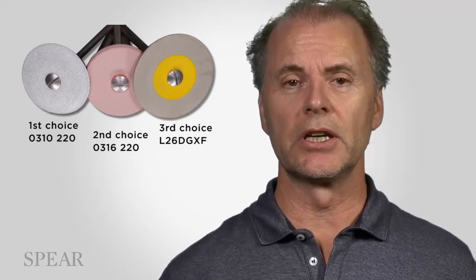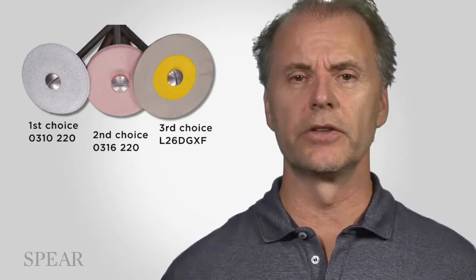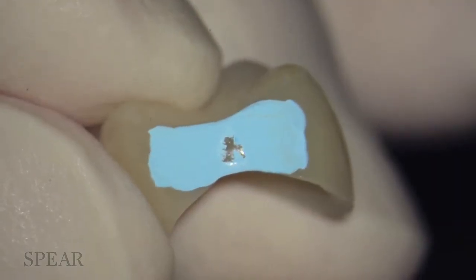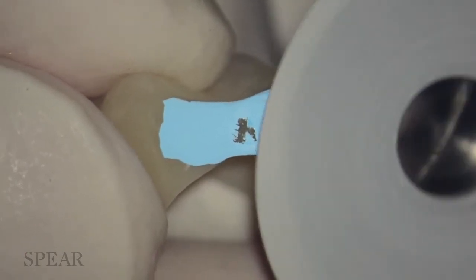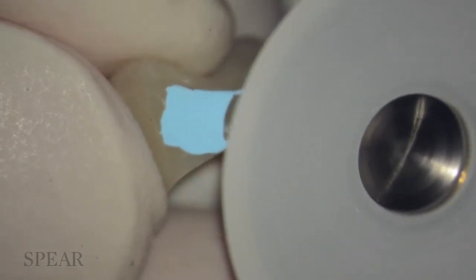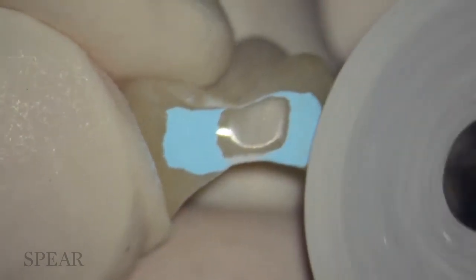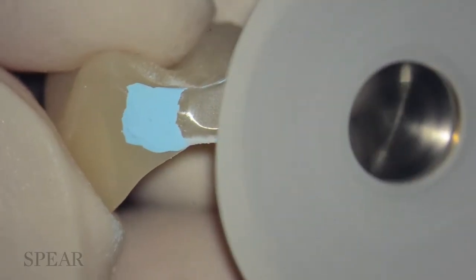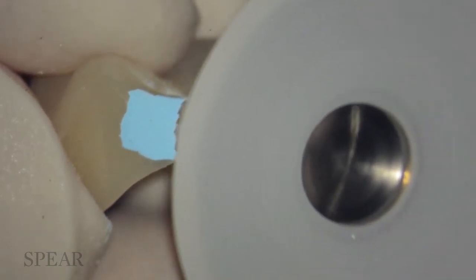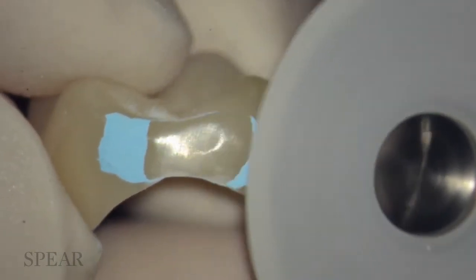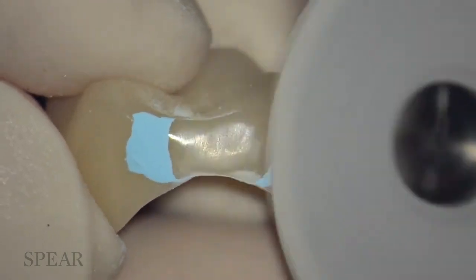The numbers you can see here. If you have an interest in pursuing finding them, you have a reference number. Here I'm going to demonstrate, now that I have the interproximal contact mark, I'm going to use the white polishing wheel. And with gentle pressure, wrapping about 8,000 RPMs, I'm manipulating that edge of the white polishing wheel on the surface. And you can take several tenths of a millimeter of ceramic off in a matter of 5 to 10 seconds. Now, I'm just shaping a little bit to prevent just a flat area.